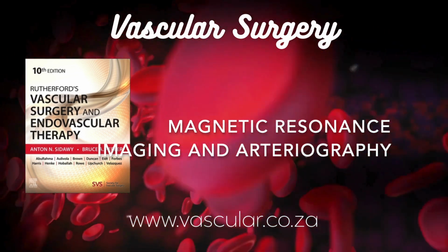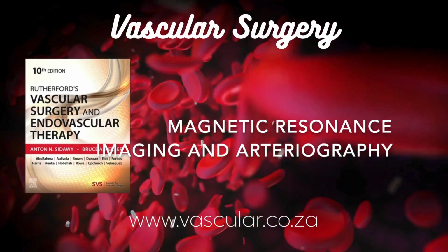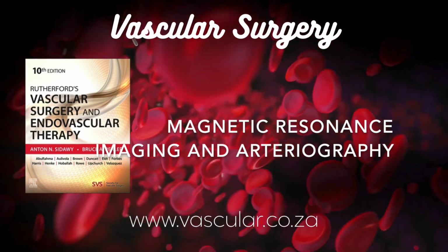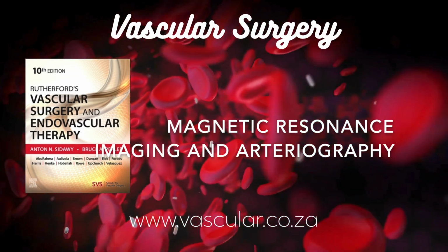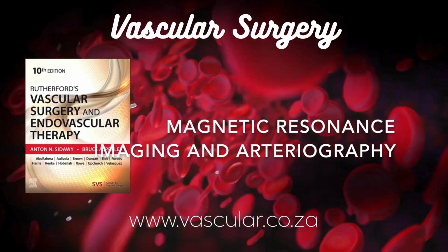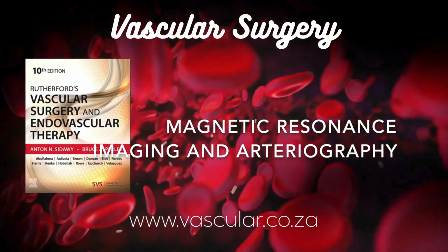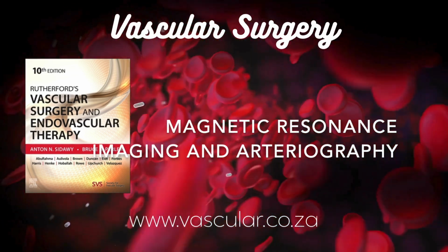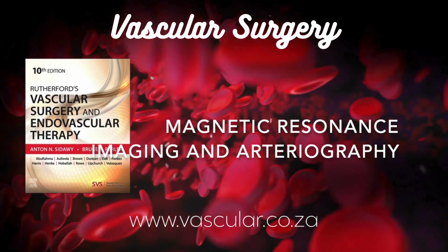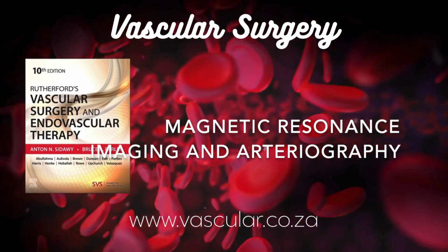But interpretation. Often, MR angiograms can be a bit easier to read because the background tissues are naturally suppressed, making the bright vessels stand out clearly. A 3D MRA might have fewer raw images to scroll through than a comparable CTA. So no single winner. Not really. The choice often boils down to the specific clinical question, the patient's condition, especially kidney function, implants, what equipment and expertise are available locally, and honestly, the comfort level of the referring doctor and the radiologist with each technique. They're often complementary tools.